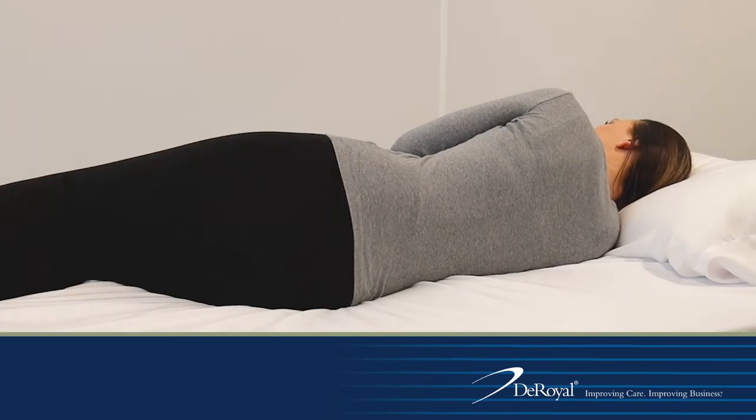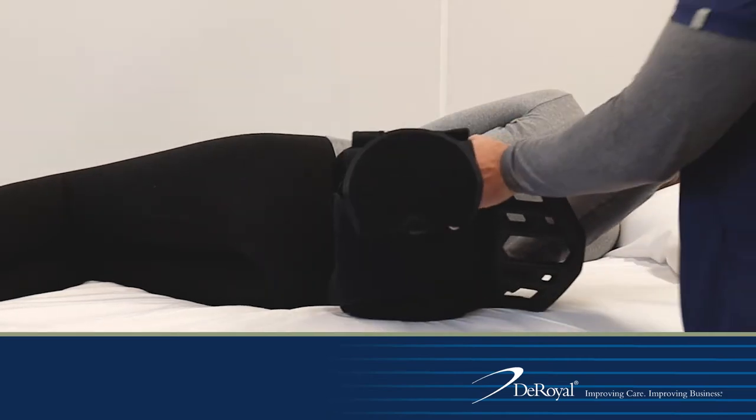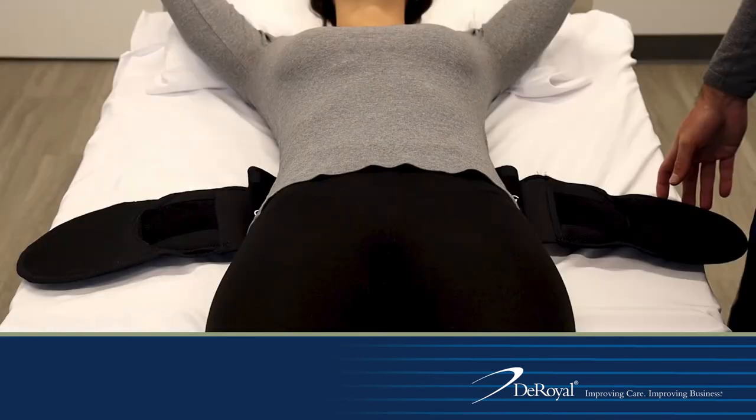Roll the patient onto their side. Place the brace in the middle of the patient's back with the bottom of the posterior panel just above the sacrum. Tuck the belt under the patient's side so it is retrievable on the opposite side. Roll the patient back into the supine position and retrieve the belt from under the patient.